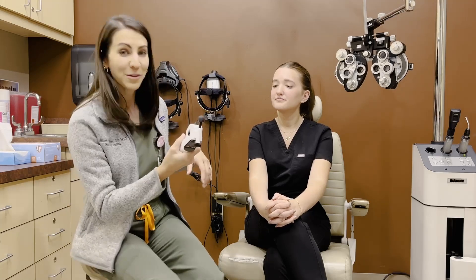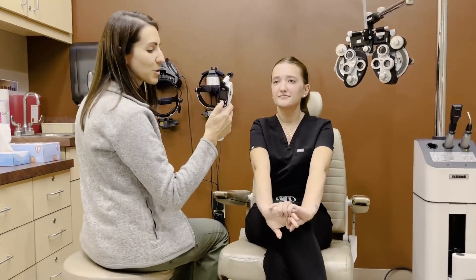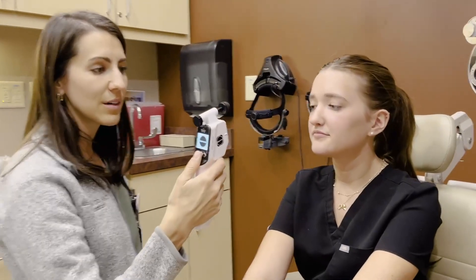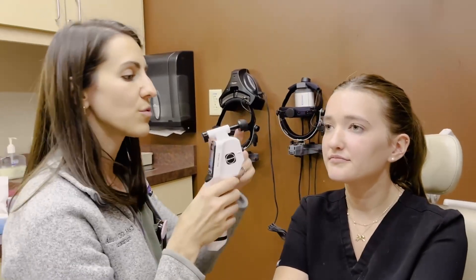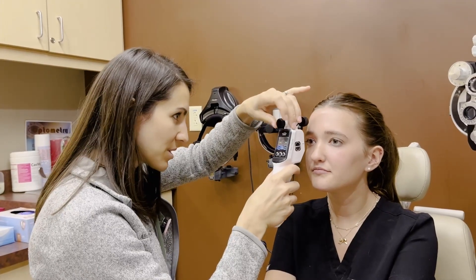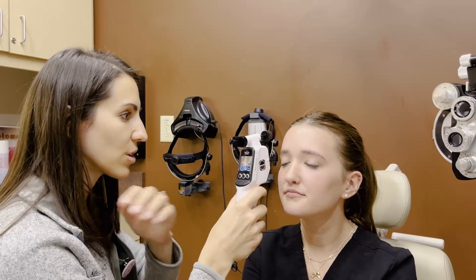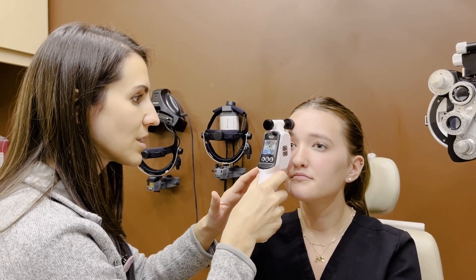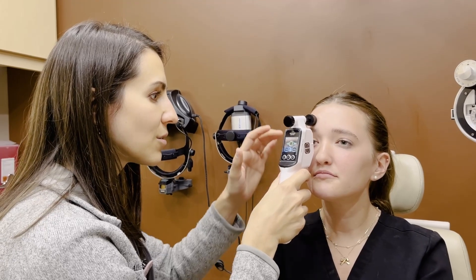I'll give you a little tour of how we use it here. It's pretty straightforward. We're going to turn the device on first with the center button here. From there, the forehead rest — we're going to rest it on her forehead and bring it towards you. Go straight ahead — you'll have your patient look across the room. And then from there, it's going to guide you with the green circle to let you know you're close enough.